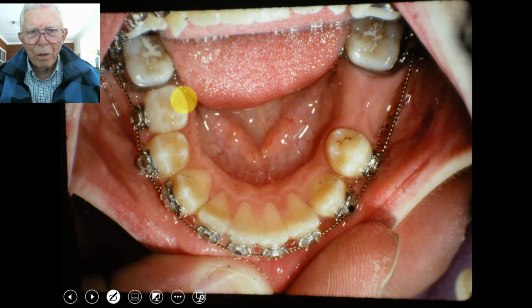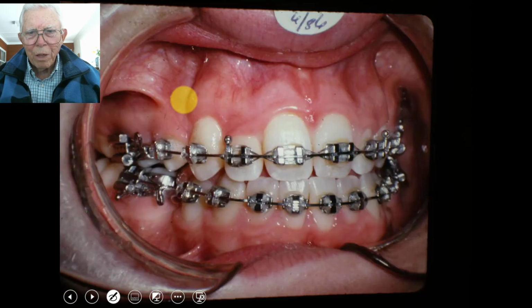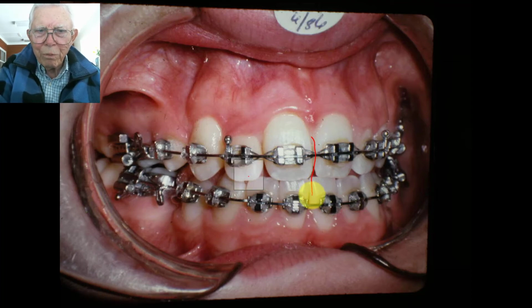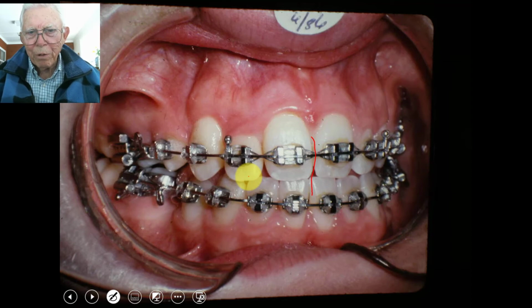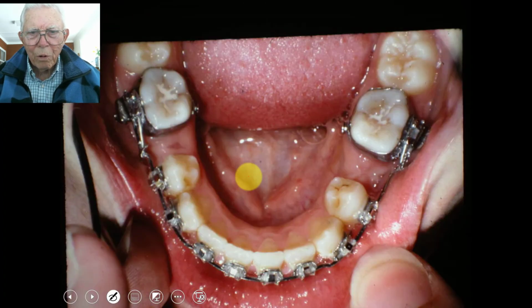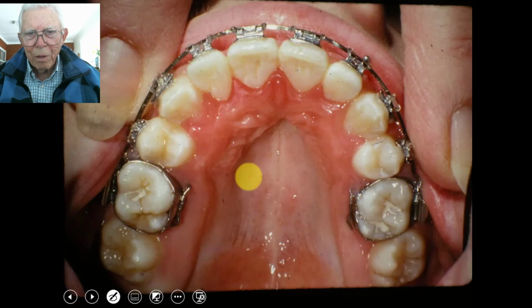Now we've eliminated some of the bicuspids and the deciduous teeth, so now our midline is coming back. The lateral looks better and the cuspid looks better also, from this standpoint. Now I'm going to go ahead and we're closing the bicuspid space on the bottom. And we've got everything lined up, and let's close the teeth.